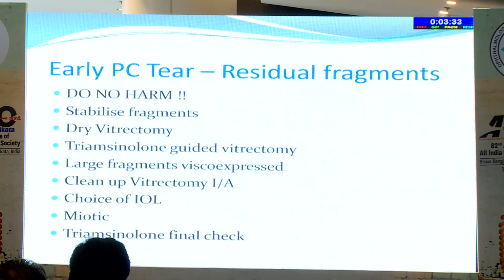Most of the nuclear matter is still in the eye. So you do the vitrectomy to get the pieces free so that you can visco express a large fragment. Always do a cleanup vitrectomy, IA. The choice of IOL depends on what stage it is.